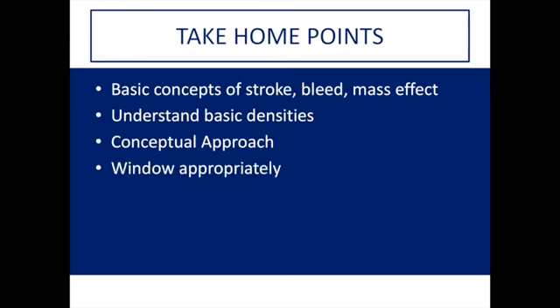Lastly, window appropriately. Understand how to window appropriately on your PACS system so you can go through your conceptual approach relatively quickly while at the same time making it more likely that you won't miss pathology that is going to change management. We gave a couple good examples of situations where windowing well helped us identify the pathology accurately.